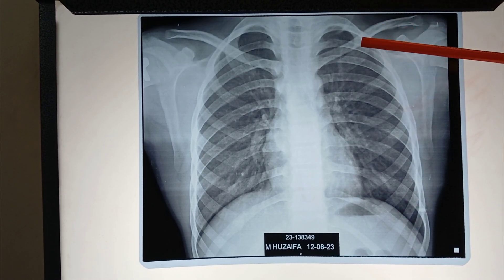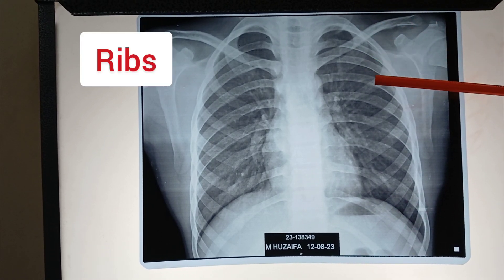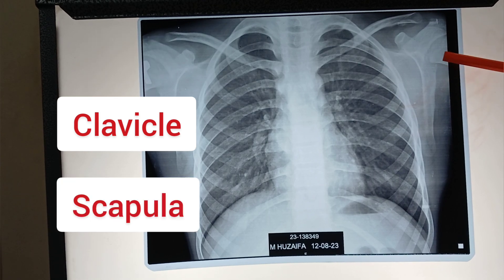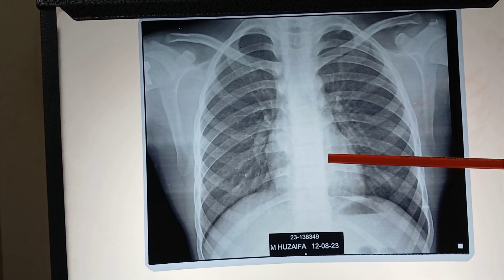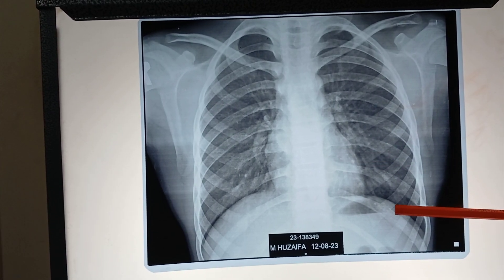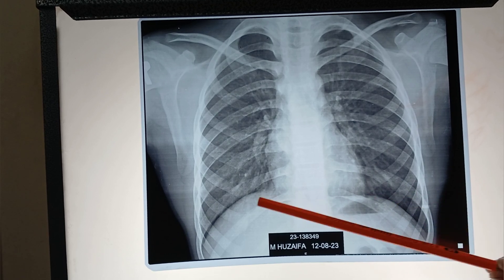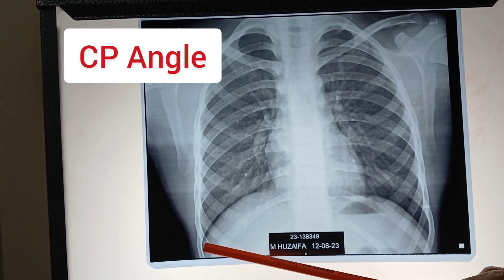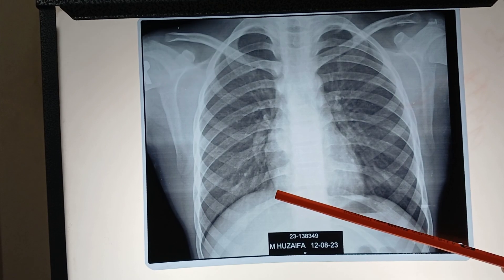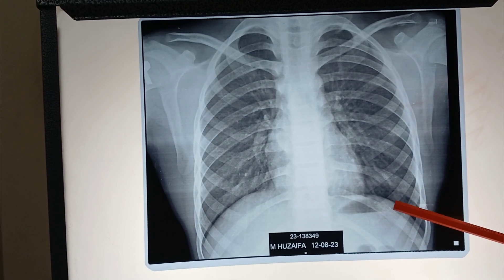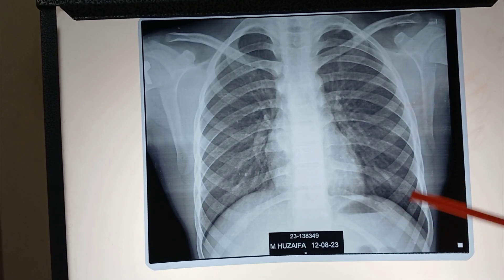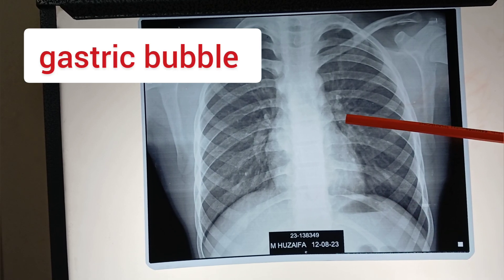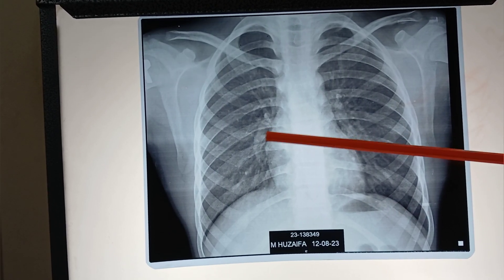These are the ribs, clavicle, scapula, humerus, heart, hemidiaphragms — left hemidiaphragm, right hemidiaphragm — right CP angle (costophrenic angle), right cardiophrenic angle, and the same structures on the left side. This is the gastric bubble. Left hilum, right hilum.